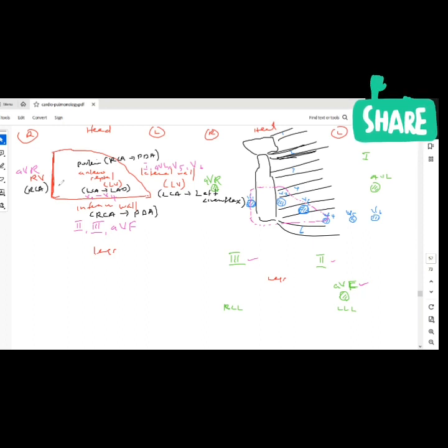So we know the walls, we know the blood supply, we know the leads that correspond to that. This is basic ECG for ischemic changes. If you're thinking posterior wall, think of the right coronary artery, PDA, with reciprocal leads V1 to V4, or I can infer posterior wall by looking at the inferior leads.